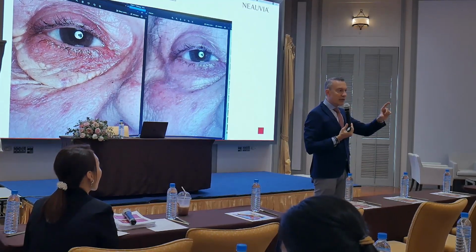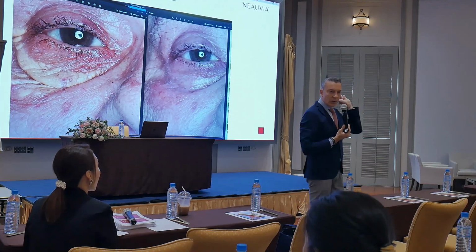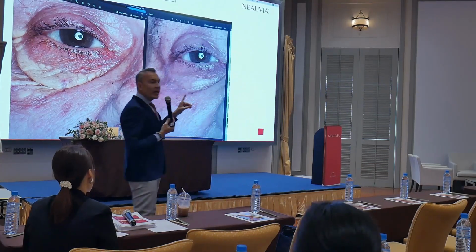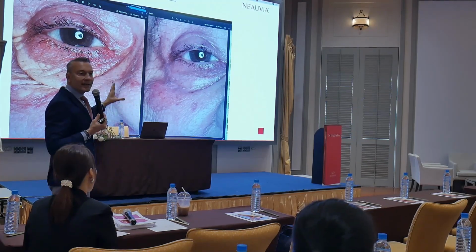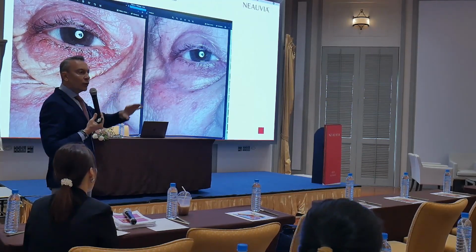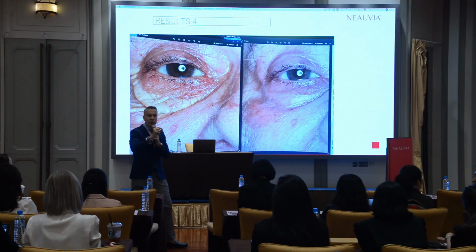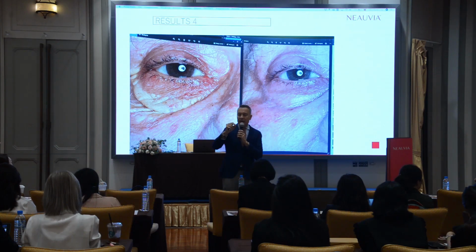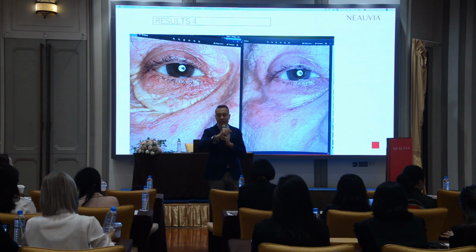Sectum with the surgical tips I showed you yesterday in the video, briefly. You can remove this also with Sectum. This is a surgical work. If you have a surgical work like this that doesn't need precision, you can do it also with plasma. Sectum is used when you do the high precision surgical procedure like blepharoplasty.